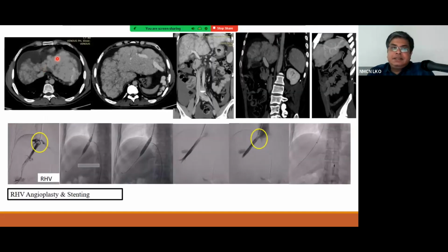So here we can say a heterogeneous liver with nodular outline, non-visualization of hepatic veins, and large hepatic and perihepatic collaterals and perisplenic collaterals. And here we can see also this small esophageal varix. This can also be visualized in these oblique reformatted sagittal images. And these are hepatic, perihepatic collaterals. At the same time, we can appreciate also this ascites.